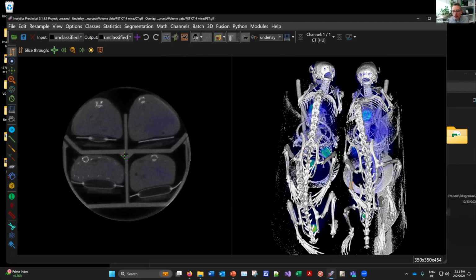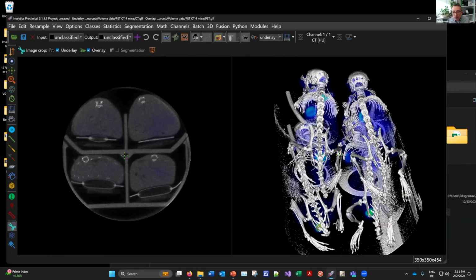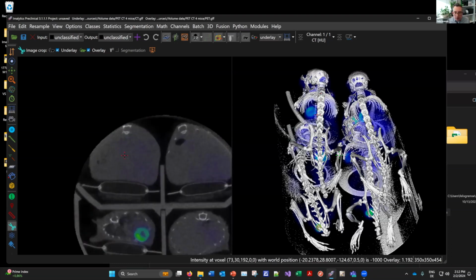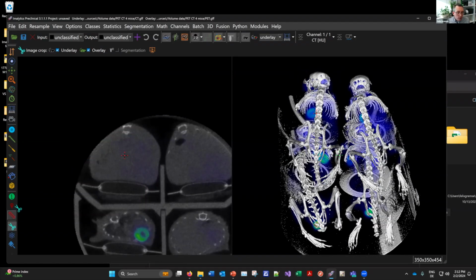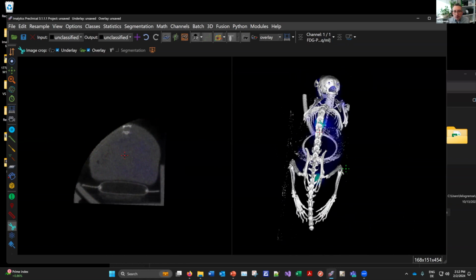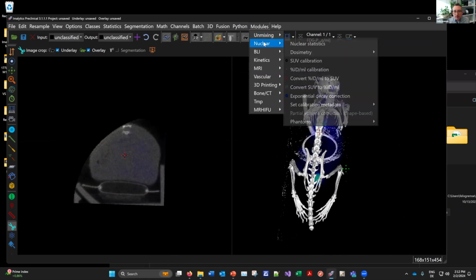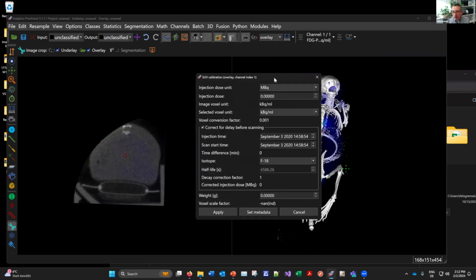And then the data needs to get split. And you can do this with our software here really easy. You can jump to one mouse here, like this mouse, in 3D, because there you can see better where is left and right. And then here with the cropping tool, you can crop out one mouse like this, and this crops both the CT and PET file.